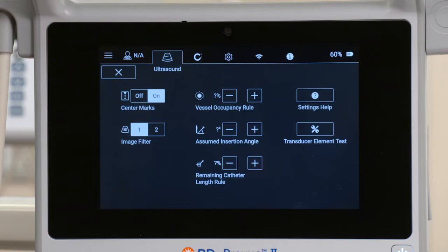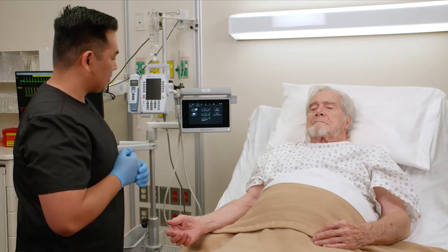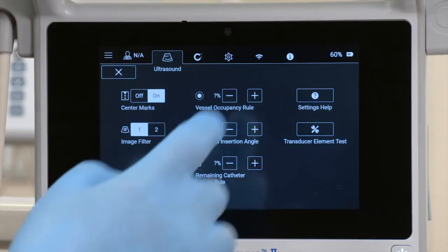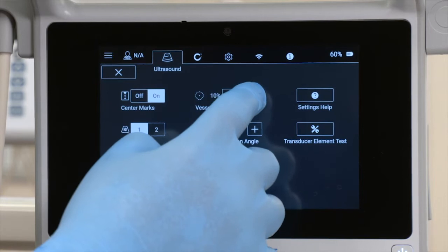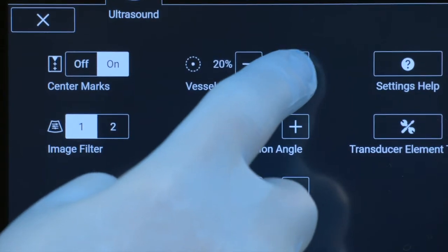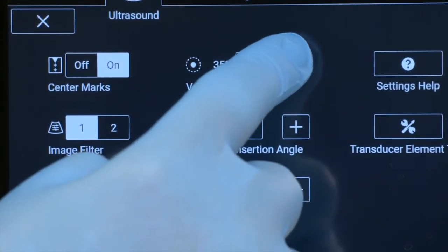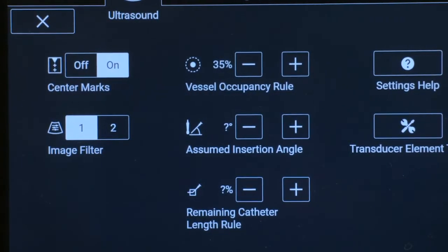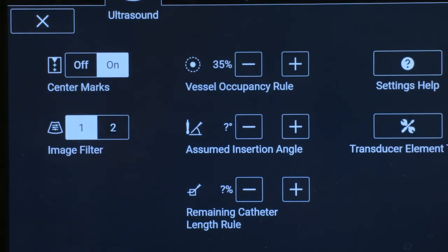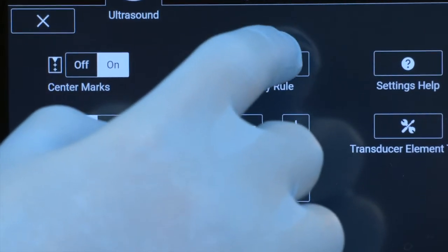For example, according to 2021 INS guidelines, catheters should occupy less than 45% of the diameter of the vessel it inhabits. The Evaluate Veins screen will indicate the maximum gauge size for the selected vessel that complies with the vessel occupancy rule.